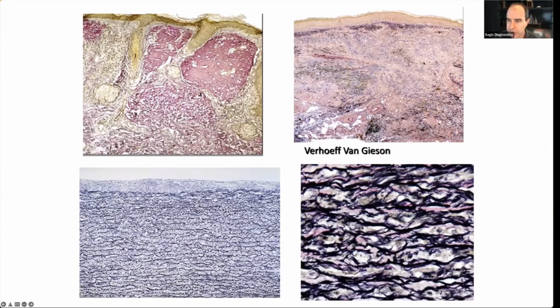But there are big holes here where there's no elastin tissue. So that tells us that's a disorder of elastin tissue, be that a scar, which can cause this, or mid-dermal elastolysis, or different things. But different characters of the elastin fibers can give you different staining patterns.